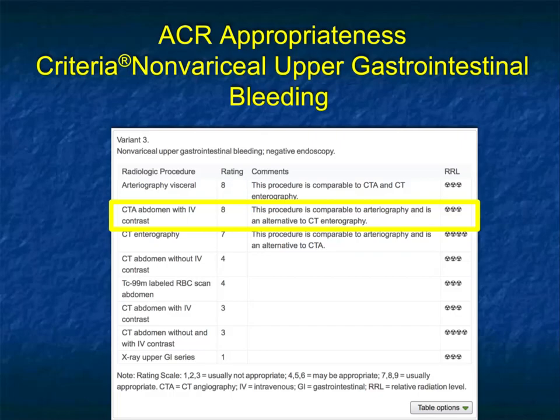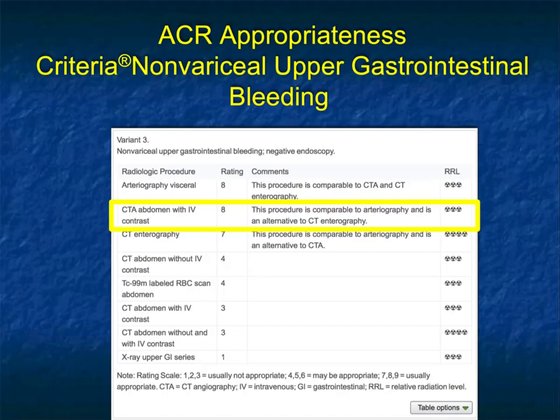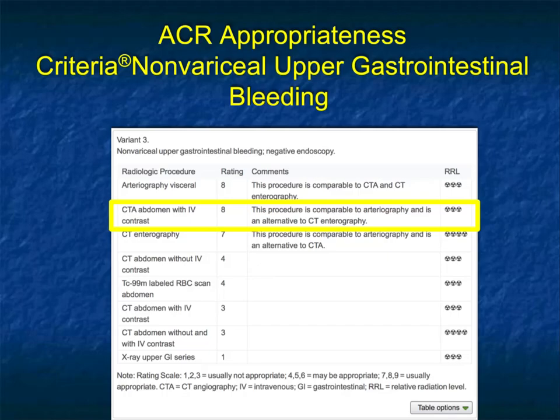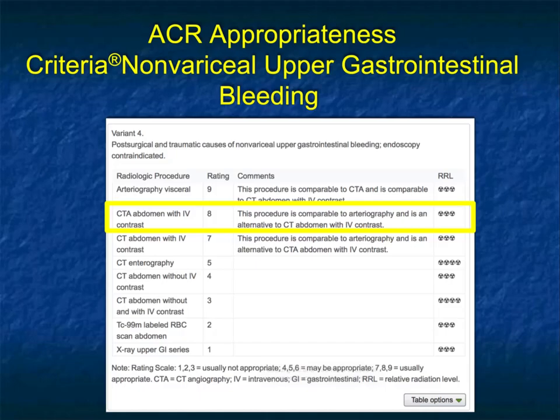In another variant — non-variceal upper GI bleeding with negative endoscopy — both angiography and CT are rated eight. For CTA, the procedure is comparable to classic angiography and is an alternative to CT enterography. CT enterography is a good study, but if doing it with water contrast I would still use a dual-phase approach and essentially perform it with a CT angio protocol. CTA and CT enterography often merge together when looking at occult sources of bleeding.